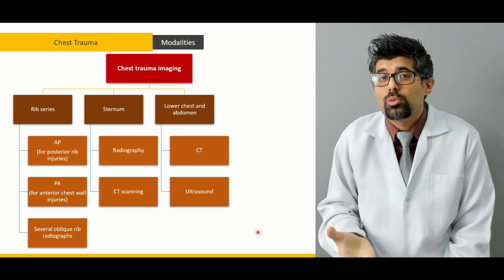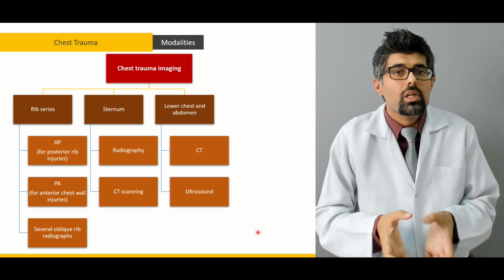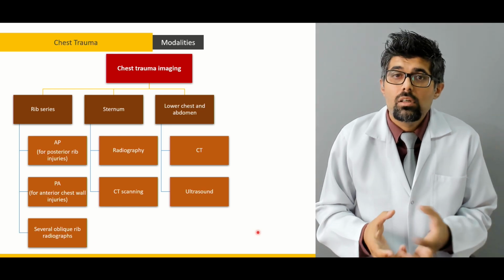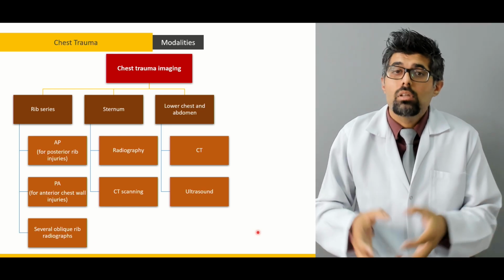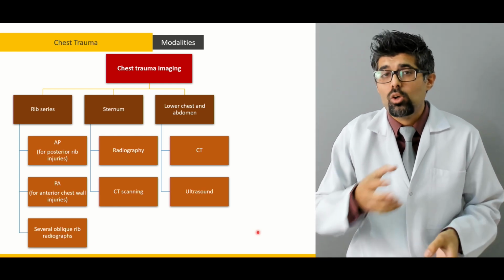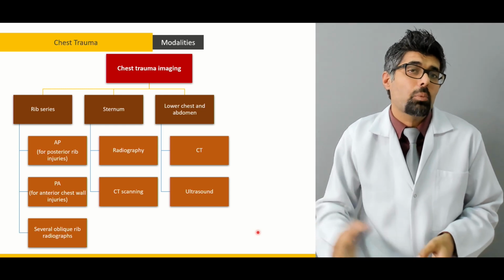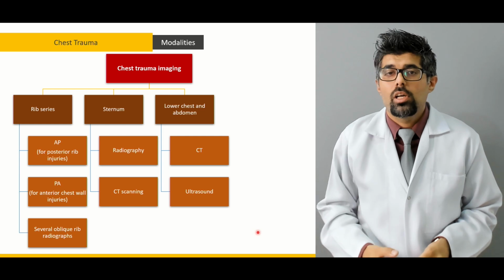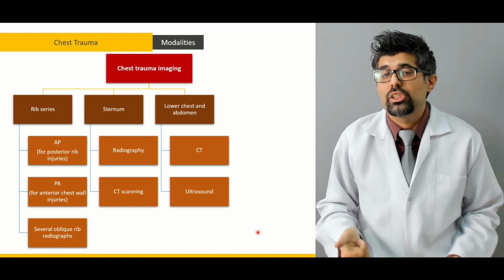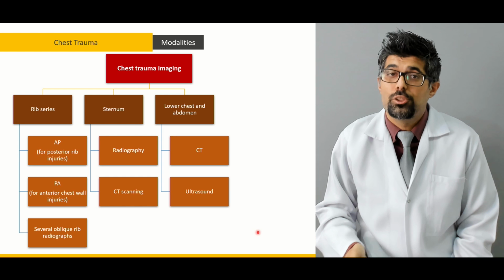Next, we also perform an ultrasound, because during ultrasound we can actually see if there is an active bleed, the site of puncture, the diameter of puncture, all of these things can be gauged and examined in real time during the ultrasound and the Doppler ultrasound. So, if the chest trauma also involves the upper abdomen, both the CT scan and ultrasound, especially the Doppler one, is used.